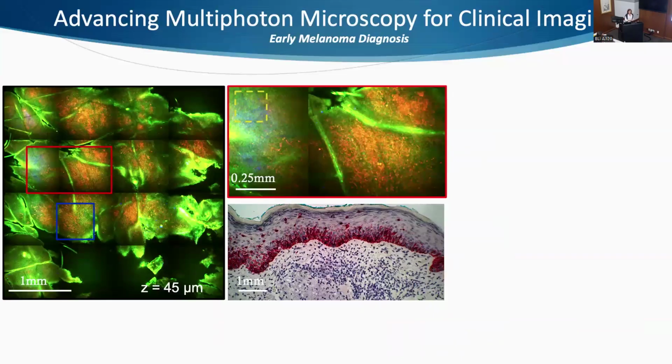Another study, another application we use this microscope for: we have a study testing the potential of this approach for early melanoma diagnosis non-invasively. And I like to show this image from a melanoma lesion, that's visually corrected for the field curvature. You can really see the tiles in this one. But what's interesting is that this really captures well the non-uniformity in the image.